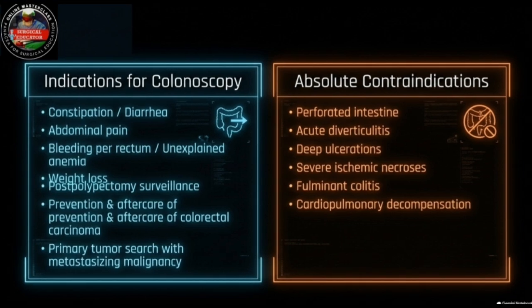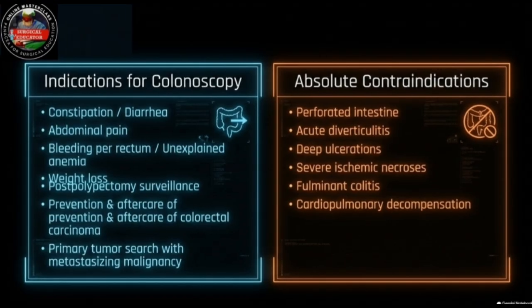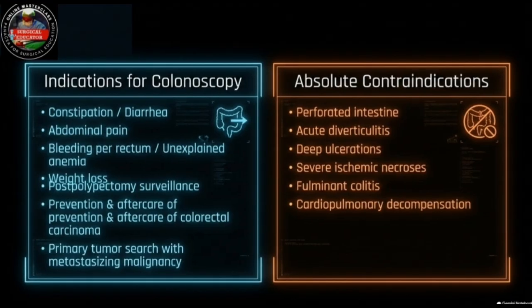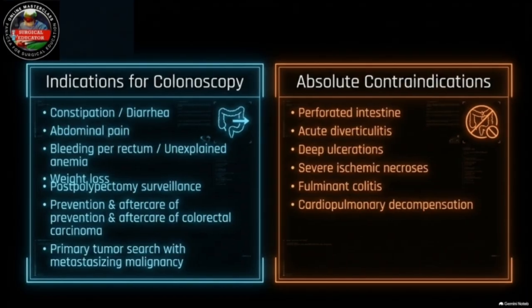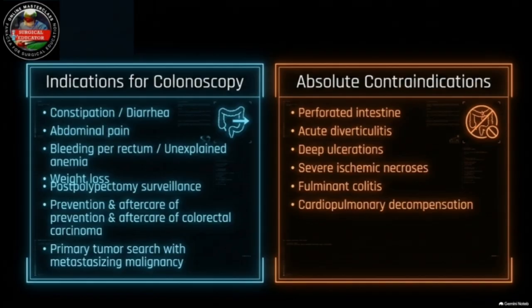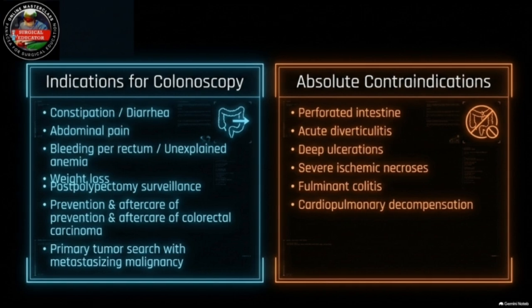Precisely. You have to pump air into the colon to inflate the lumen, otherwise you can't actually see where you're going. So if you pump air into a colon that is already structurally degraded by fulminant colitis, the pressure will literally tear the tissue apart. Oh my God. Yeah. The risk of causing a procedure-induced perforation vastly outweighs any diagnostic visual you might gain. So the very mechanism required to see, the air pressure, literally turns the tool into a hazard.